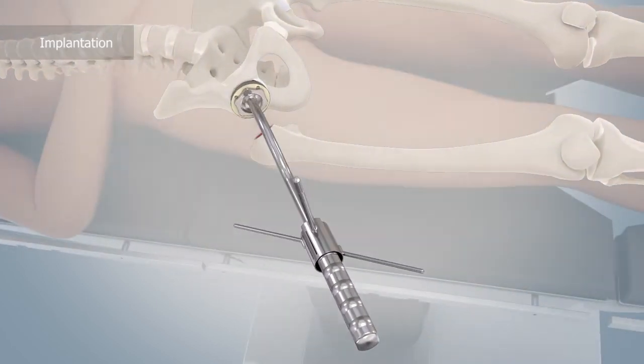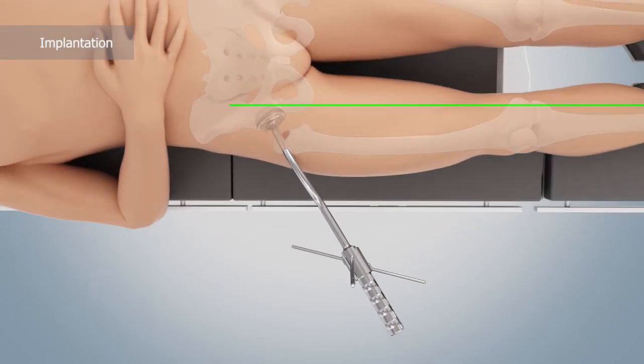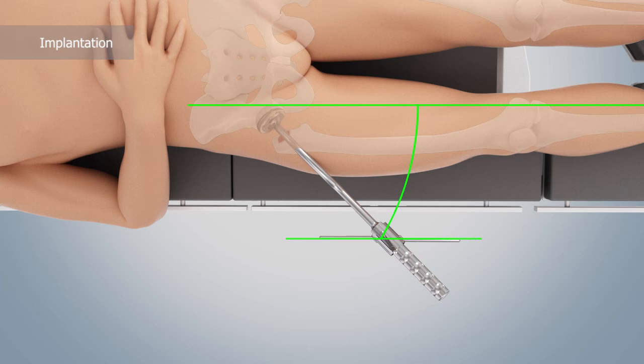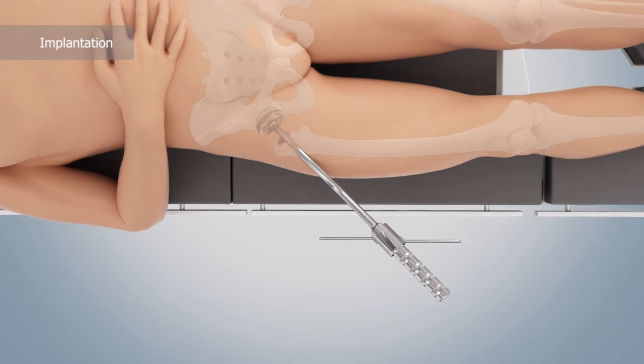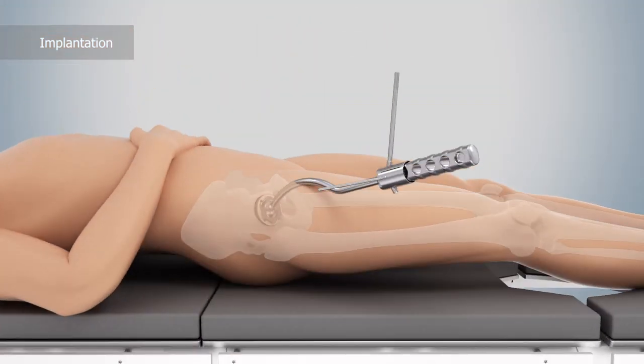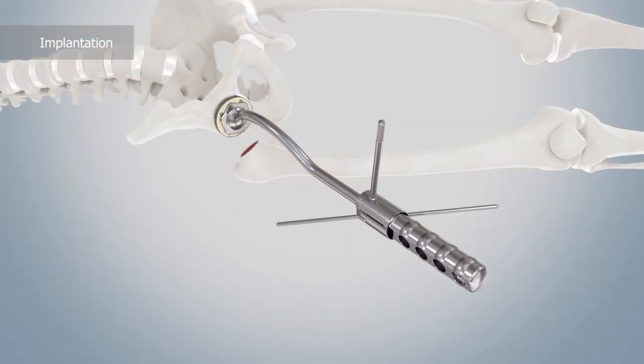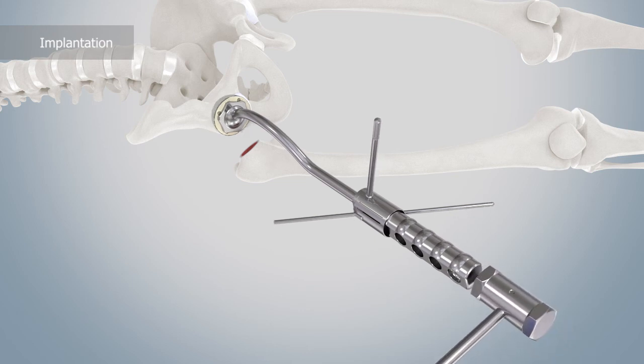Due to the high primary stability of the RM Pressfit cup, the correct orientation of the cup is set before the implant engages into the bone during impaction. The RM Pressfit cup is driven in with the desired inclination and anteversion. Here, the operating surgeon will notice that the impact behavior of the RM Pressfit cup differs from the impact behavior of classic metal back cups.